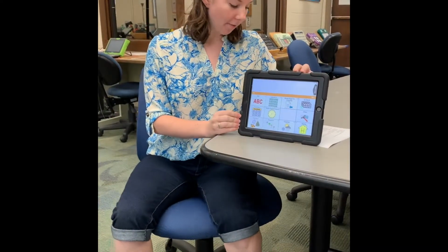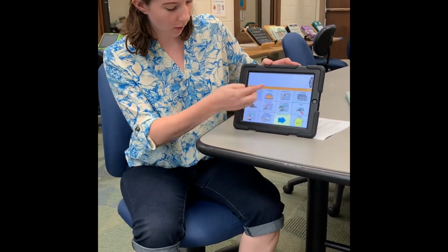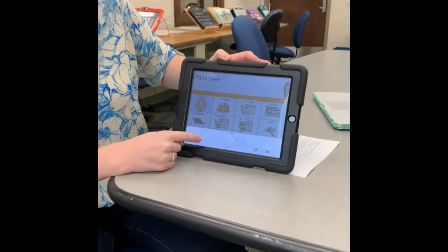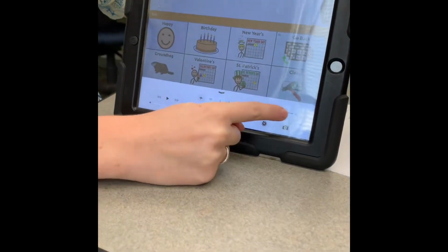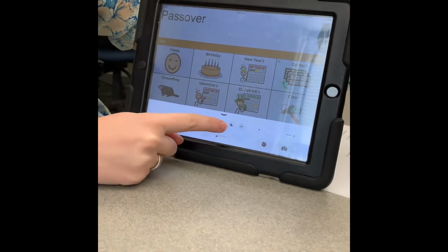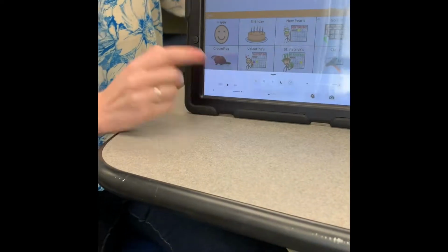The device itself offers brightness adjustment and auto lock options by simply swiping up from the bottom. You can adjust the brightness, you can access a camera, or any of the settings such as Bluetooth, access to Wi-Fi, or volume control.